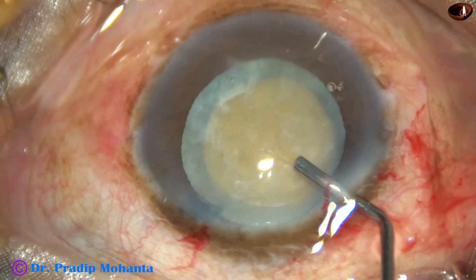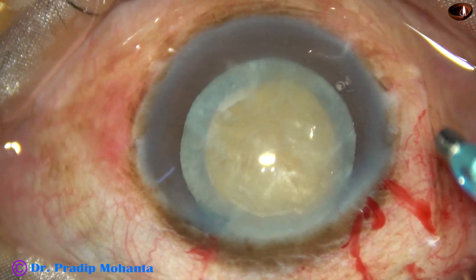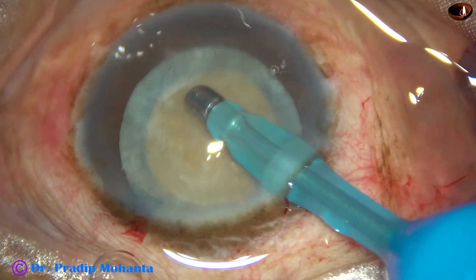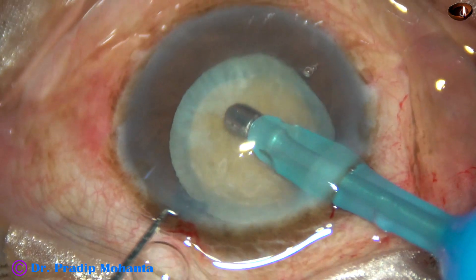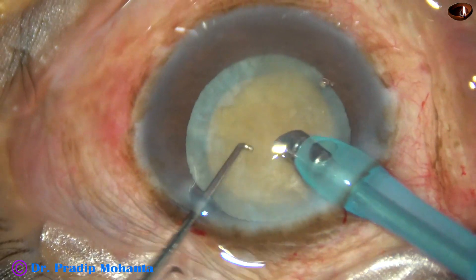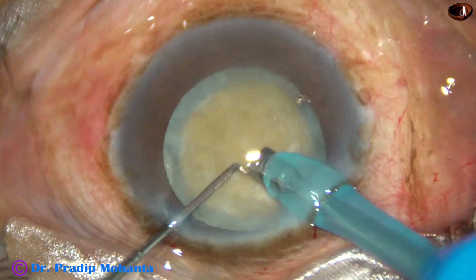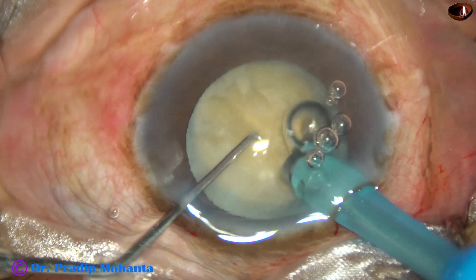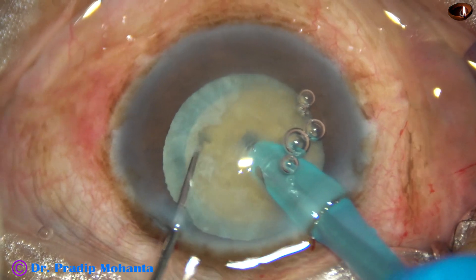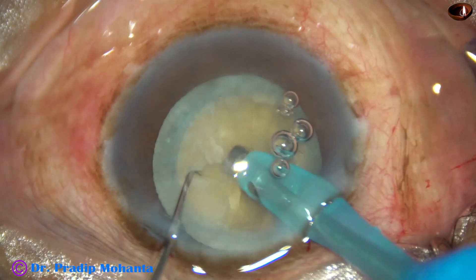Viscoelastic is injected — this is 2% hydroxypropyl methyl cellulose. Now the tip of the phaco handpiece is introduced into the anterior chamber. The bevel is down. Some superficial lens matter is removed, and now I'm going to do direct chop. The tip of the handpiece is buried into the substance of the nucleus, and the phaco needle travels through the nucleus for some distance, then I divide the nucleus into two halves.